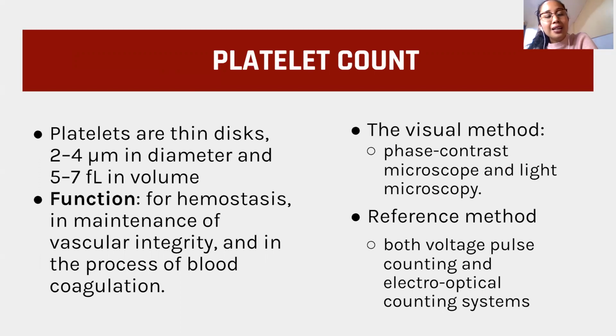So the coagulation system will not work without the contribution of platelets. Okay? So class, the laboratory activity is focused on the visual method. The two methods shown are phase contrast microscopy and light microscopy. Class, we don't have phase contrast at the University of Baguio. However, we just subdue the light by lowering the light. Sad. That is light microscopy.